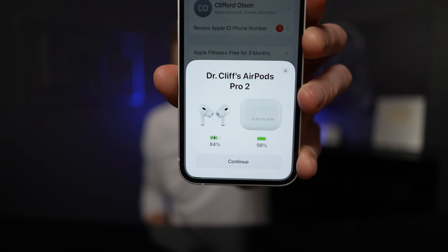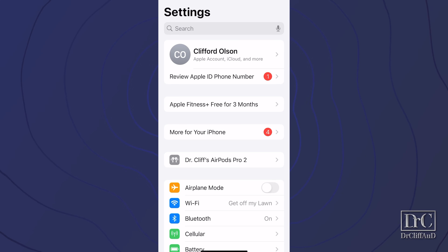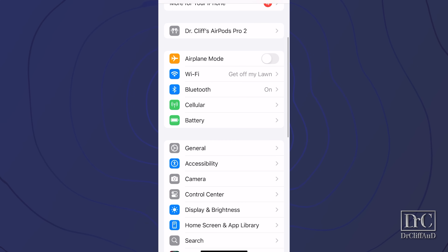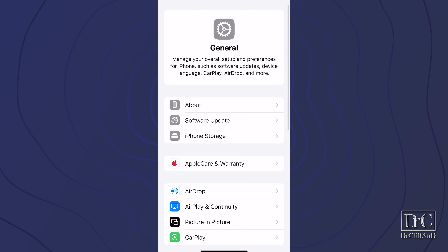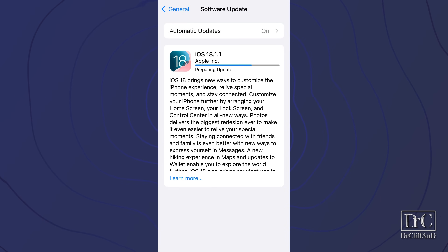Once you have them connected, you'll be able to see the battery life of the AirPods Pro 2 and the charger case. Once your AirPods Pro 2 are paired with your phone, you will need to ensure that you have the proper iOS software. Open your settings, scroll down to general, tap on software update, and ensure that you are at least updated to iOS version 18.1. If not, go ahead and start the update process. Your AirPods Pro 2 will not function as hearing aids until you have updated to this iOS version.